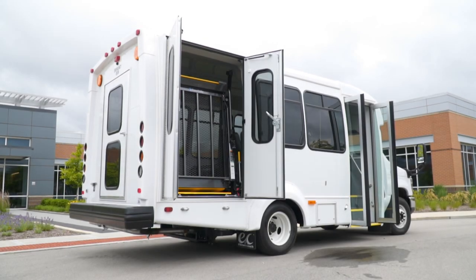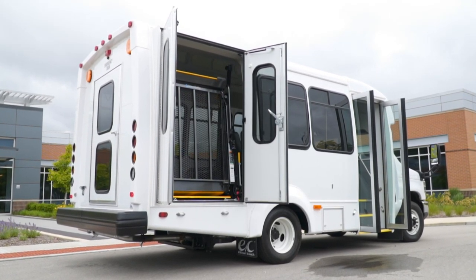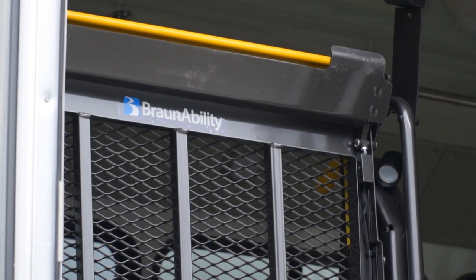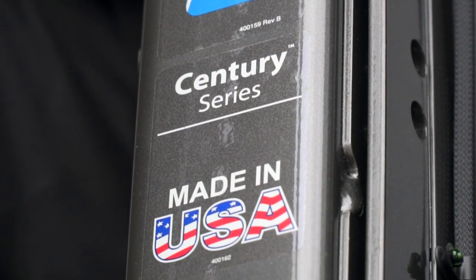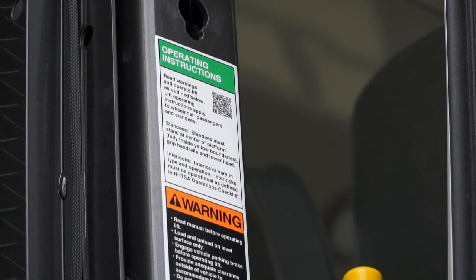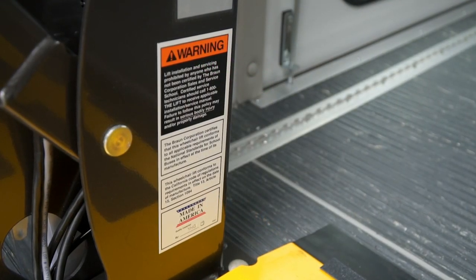Welcome to the worldwide family of BraunAbility lift owners. We created this program to help you get the most out of your BraunAbility wheelchair lift. Over the next few minutes we will highlight the operation of the lift and offer tips on basic maintenance. However, this video is supplementary to the instruction provided in the manual and is not a substitute for reading the manual and following its instructions and warnings.